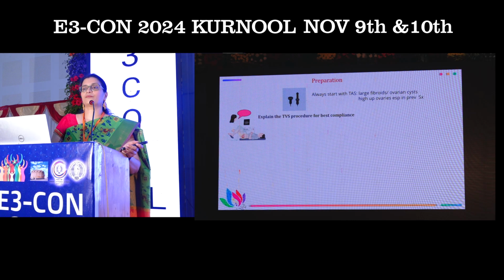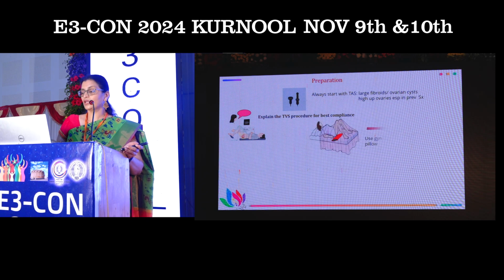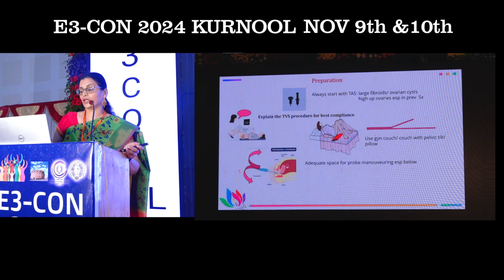So explaining the transvaginal procedure before starting the scan puts the patient at ease and gives us maximum compliance. If the lady contracts her pelvic muscles, it will be very difficult to maneuver the probe. So it is always best to start the scan after counseling the patient adequately. And use a gynae couch, or a couch where you can lift the middle part of the pelvis so that you can maneuver your probe in this area. Or using just a pillow underneath the patient's buttock will give us best views of the pelvic scan.